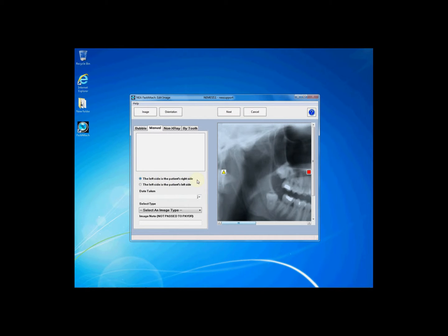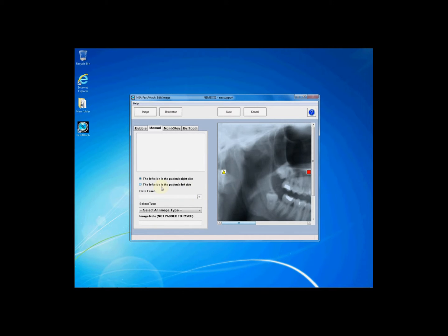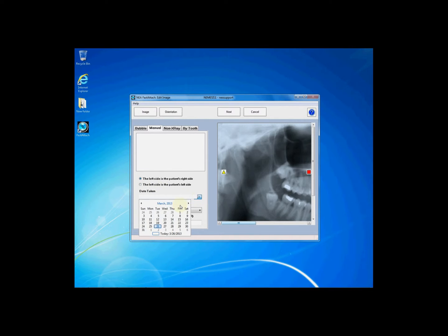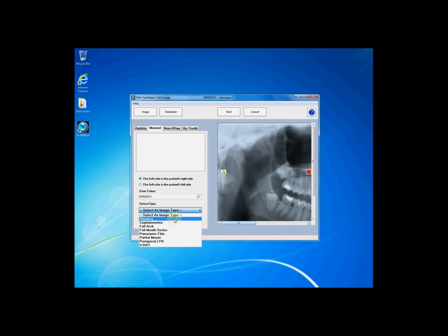you will need to choose whether the left side is the patient's right or the patient's left side. If you are looking at the teeth as though you are face-to-face with the patient, the left side is the patient's right. If you are looking at the teeth as though you are on the tongue looking out, the left side is the patient's left.